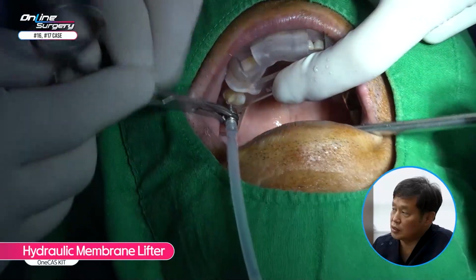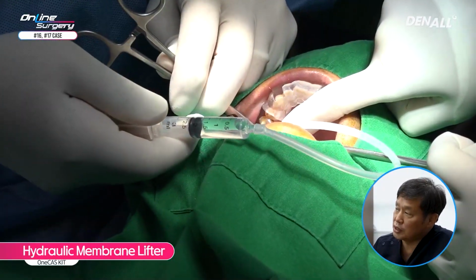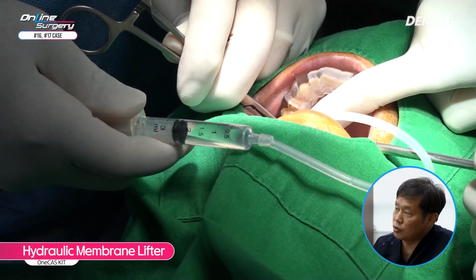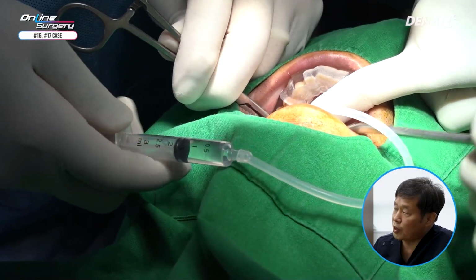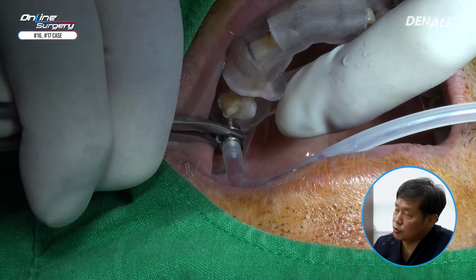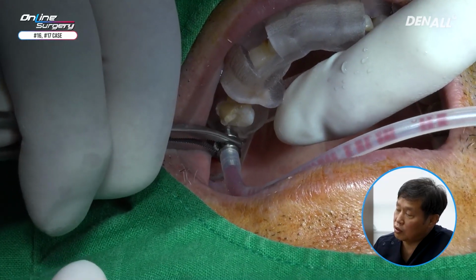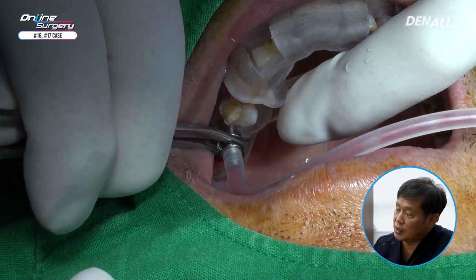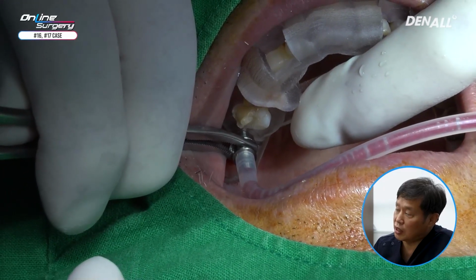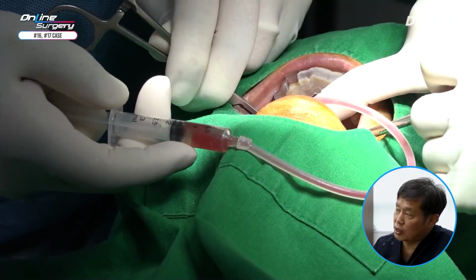Hydrolift is done with a template. A 3 cc syringe is used to advance at 0.5, and then aspiration is done with repetition. You can see that we're going in. Upon aspiration, blood regurgitation is observed. There's very little air, so there's a negative pressure. Sinus membrane. This means the sinus membrane has been lifted without puncture.